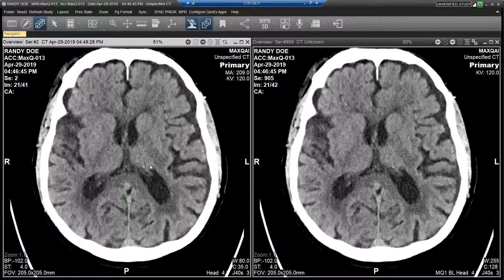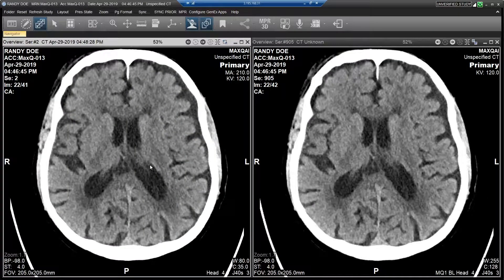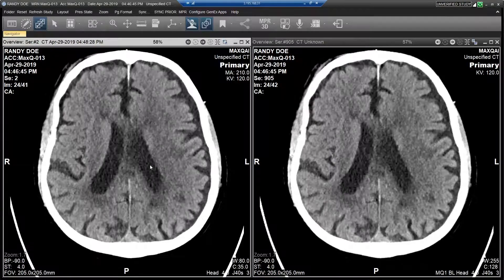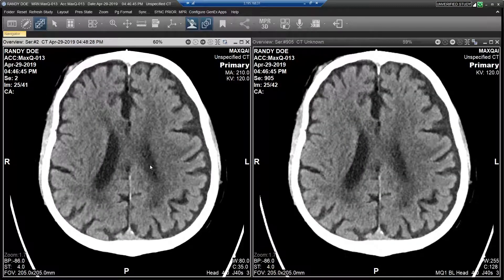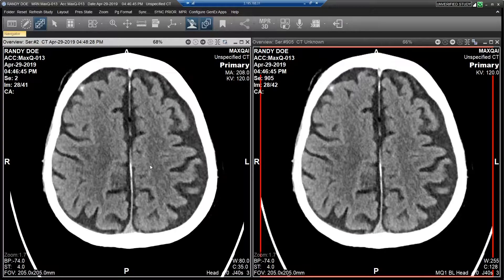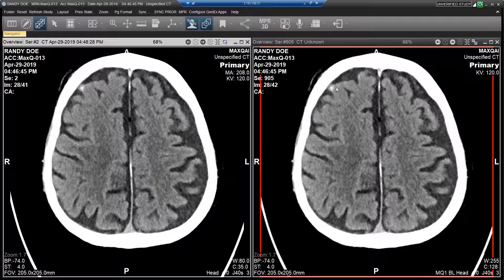The two viewports are synchronized so that as I step through the slices of the primary exam, the AI series follows. When I come to a slice where ICH was detected, I see a red border around the image. This lets me know I should focus more of my attention on this particular slice.